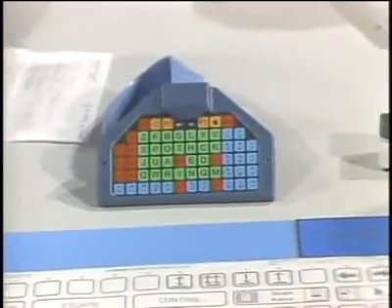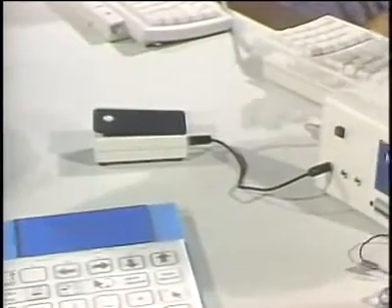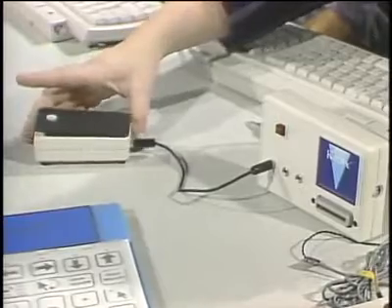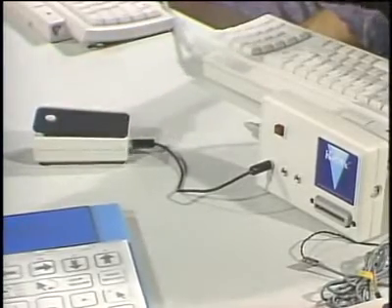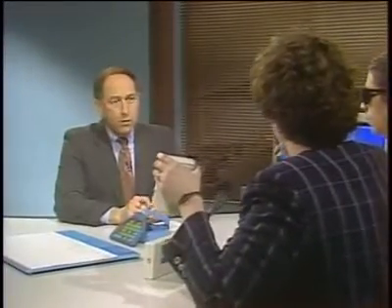Okay, and what else do you have there? I brought along several switches, and those are used by people who have single controlled muscle movement. So even if you can position this under your chin or at head level or on a lap tray on your wheelchair. There's even a specialized switch that if you have an eyebrow wrinkle, you can use your Macintosh computer. Just by wrinkling a muscle, you can operate the computer. That's correct. Okay, we're going to go back and take a look at that in just a second.